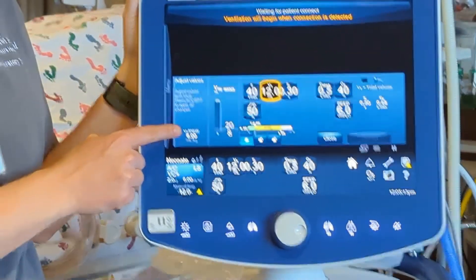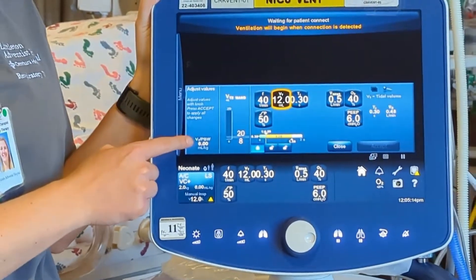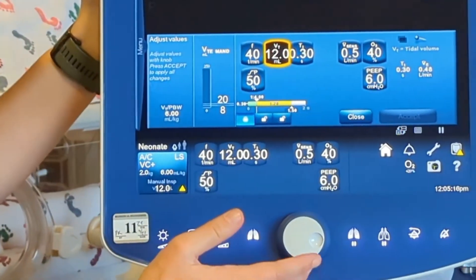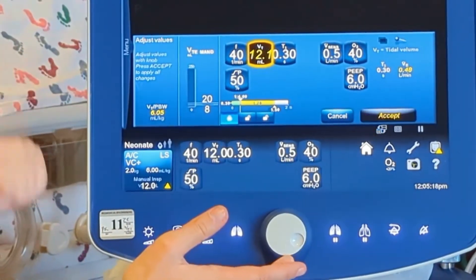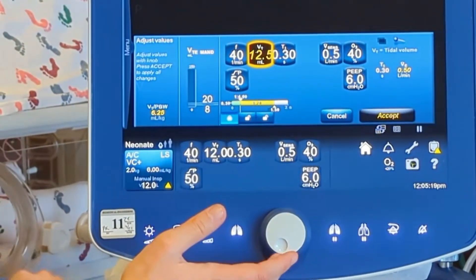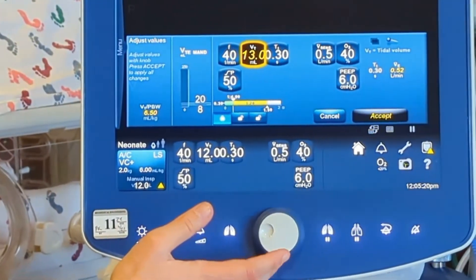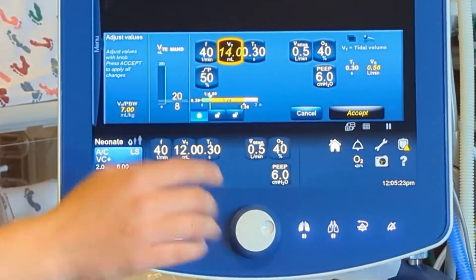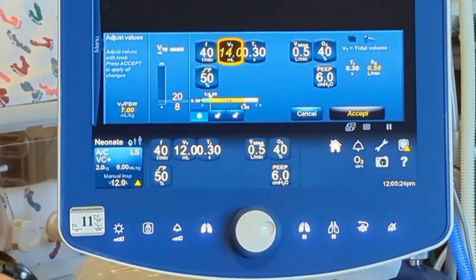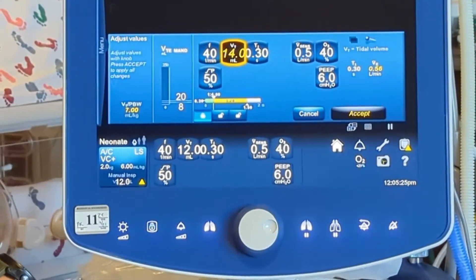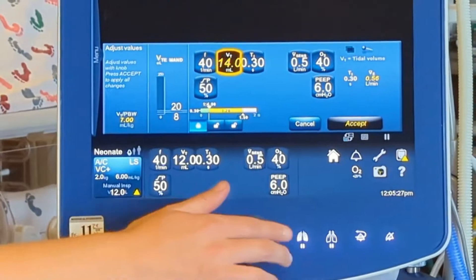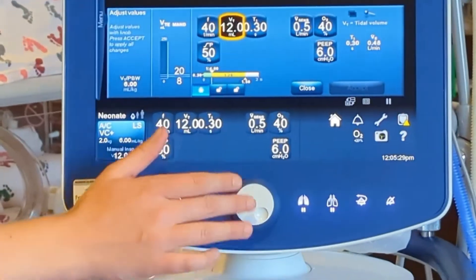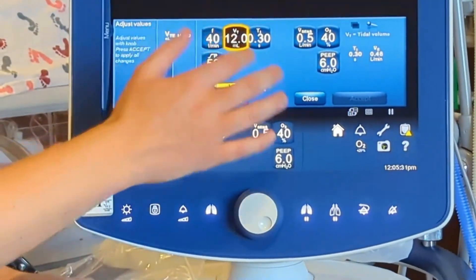It's going to show you down here that they're being ventilated at 6 mL per kg. If I adjust this, you can see it changing. So if we went to 14 mL, they'd be ventilated at 7 mL per kg. We'll go back to 12 — that's where we like to stay.